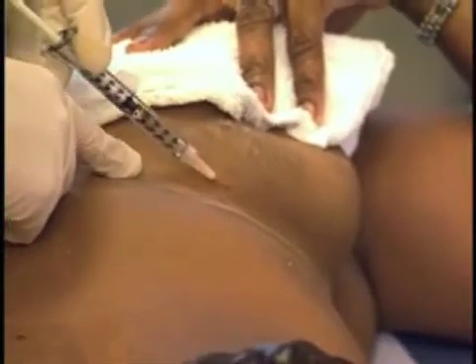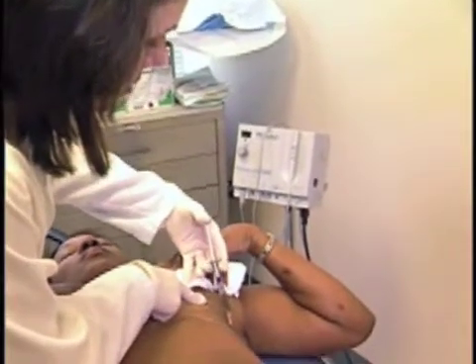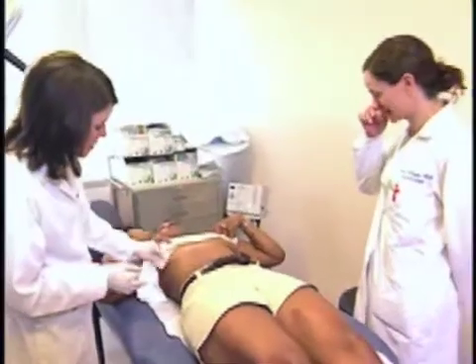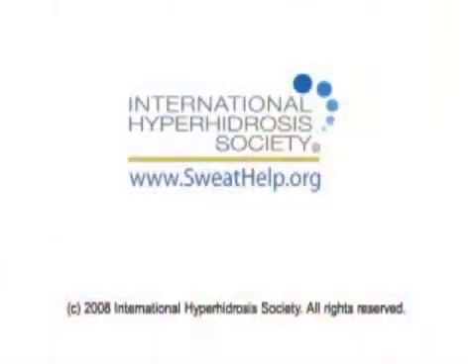Inject 3 to 5 units of Botox every 2 cm into the dermis sub-Q junction. When the area is covered, repeat the procedure for the other side. Patients usually experience little or no discomfort.